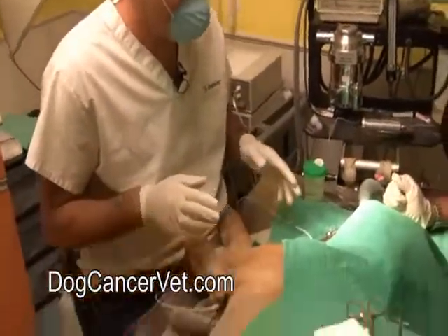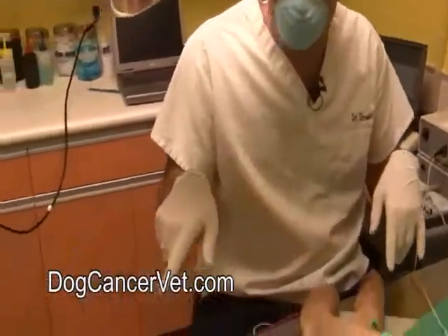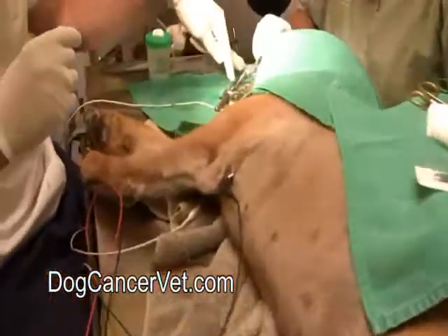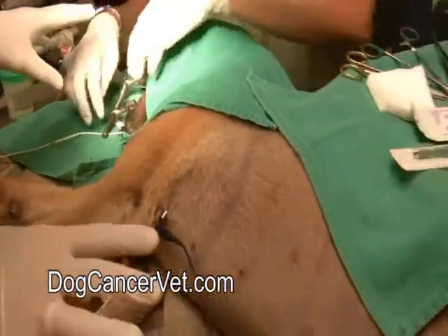Here we're with Bjorn and he's been anesthetized. He's all hooked up to his monitors, we're keeping track. You can see over here we've got his heart, the ECG trace going. We've got his blood pressure, which measures blood pressure, make sure it doesn't get too low. There's his cuff. I've got another little clip right here on his tongue that measures how much oxygen saturation is in his blood.